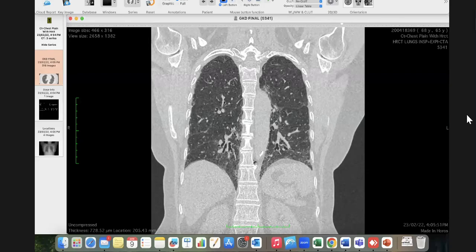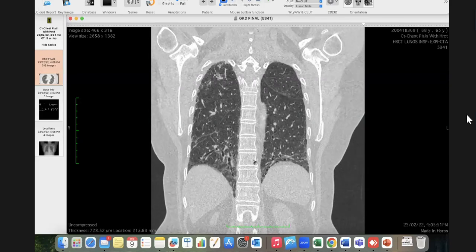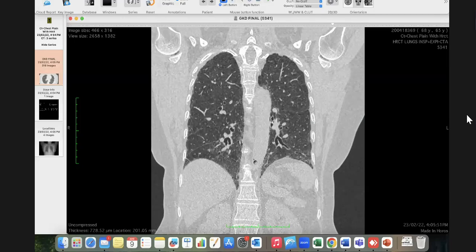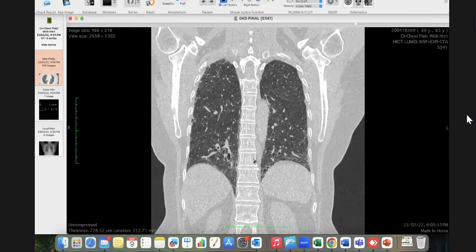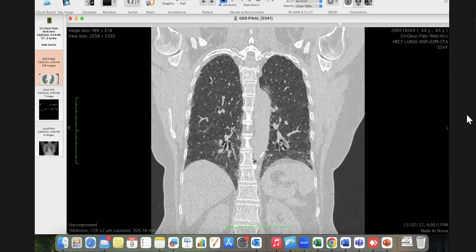I will ask him what he is thinking, and I will frankly communicate my state of mind to him, and I will advise him that either you should go in for a follow up or this is a right candidate to get a biopsy done, because I am not sure whether this is probable UIP or because of the history of connective tissue disorder, it is NSIP.